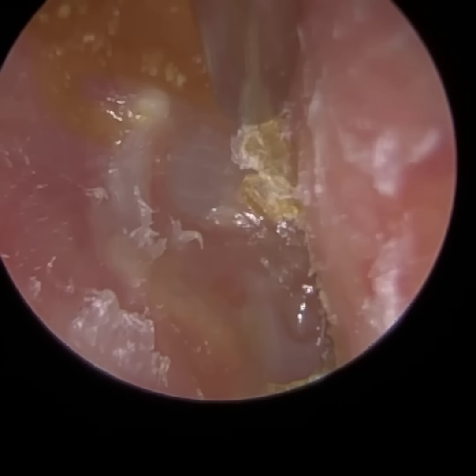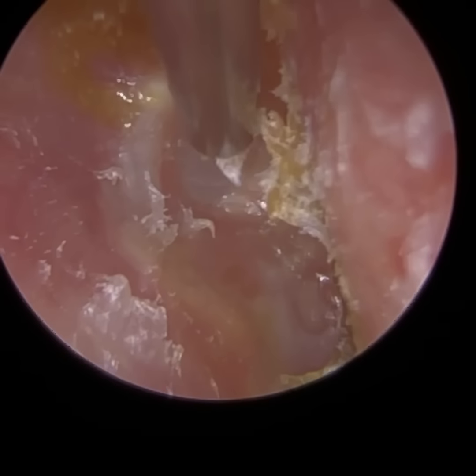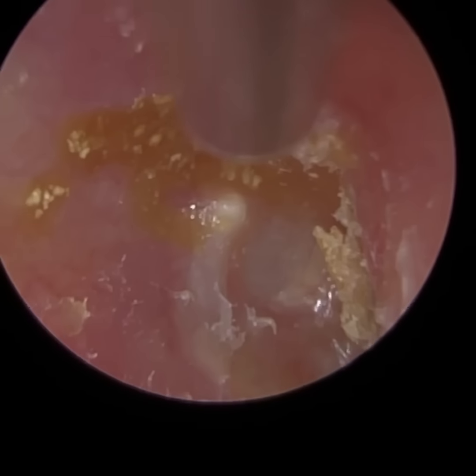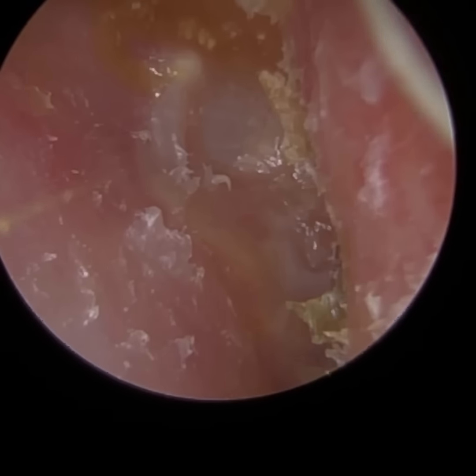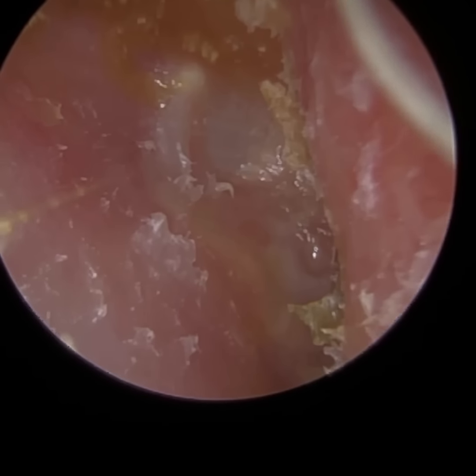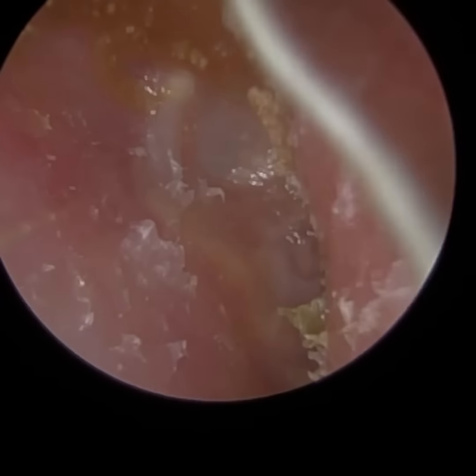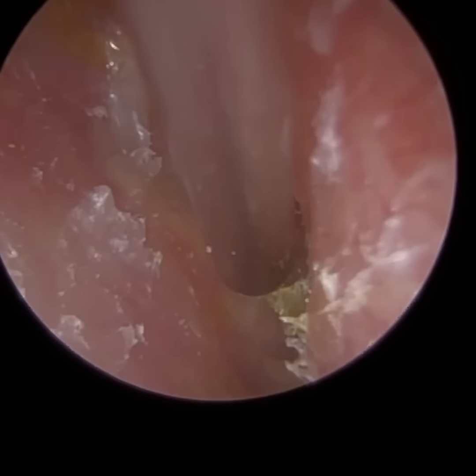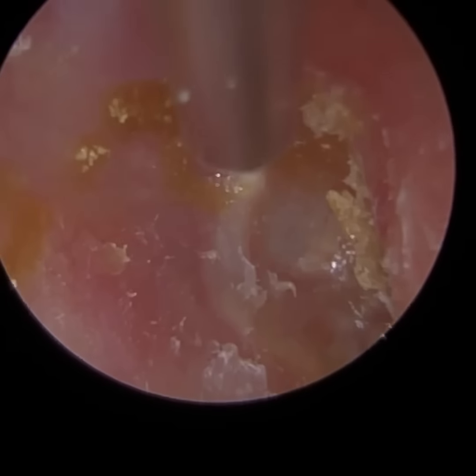Now, why is this patient's skin failing to migrate? Why is it all collecting deep in the ear? Why is it crusted around the ear canal? Now, there's a number of reasons. Some people lose the ability for the skin to migrate. For example, some patients who undergo radiotherapy around the ears, the process of undergoing radiotherapy can stop the skin from migrating.